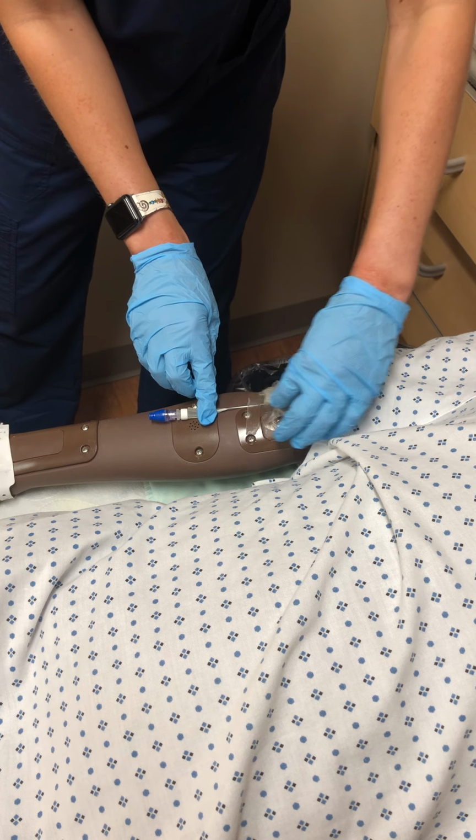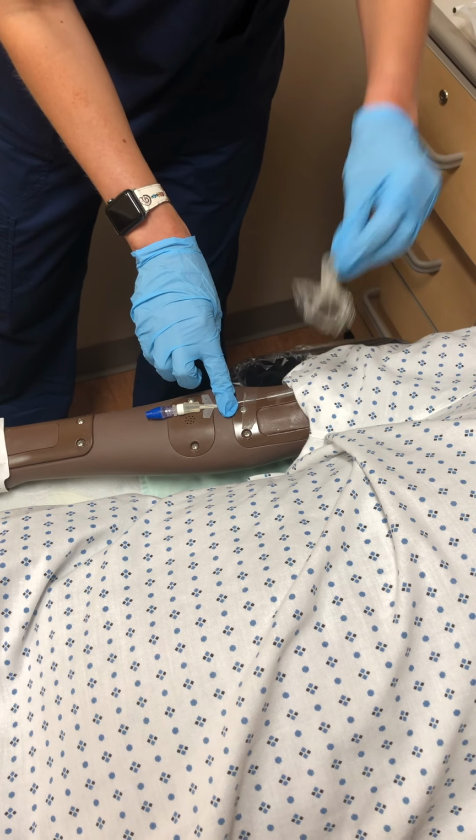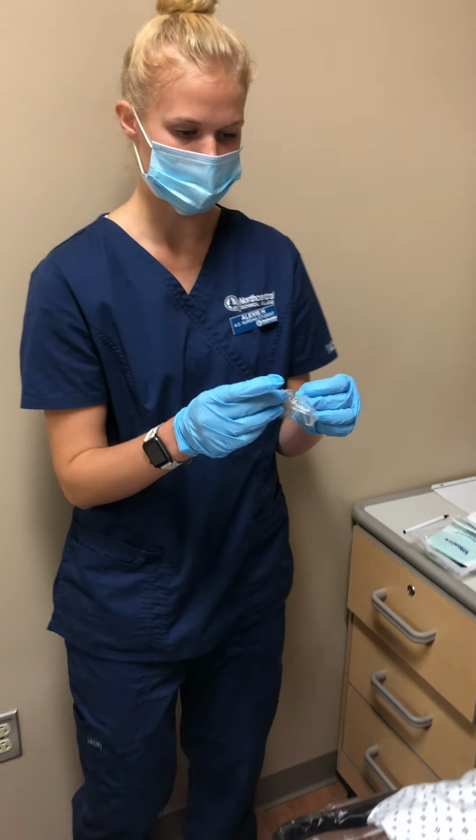Go out and in. Then I would note the drainage and the amount. So none for the drainage, and the amount is none.